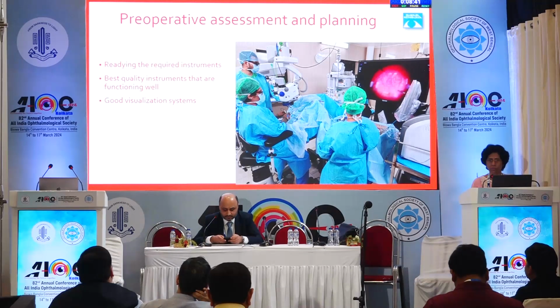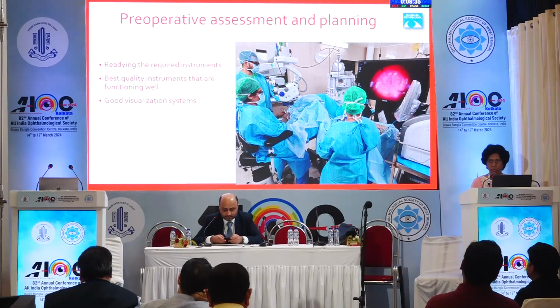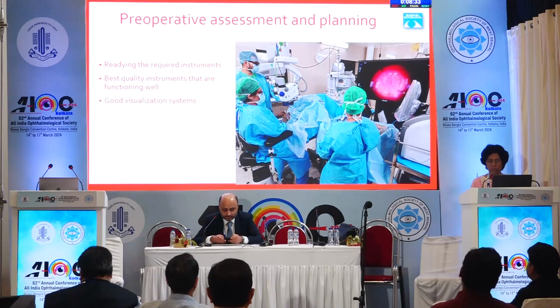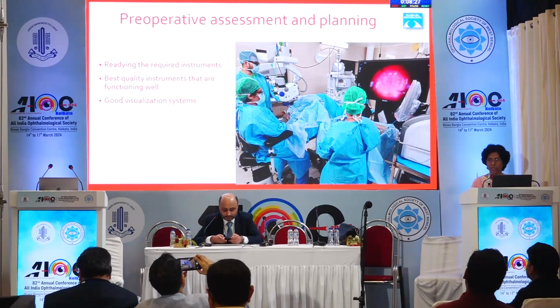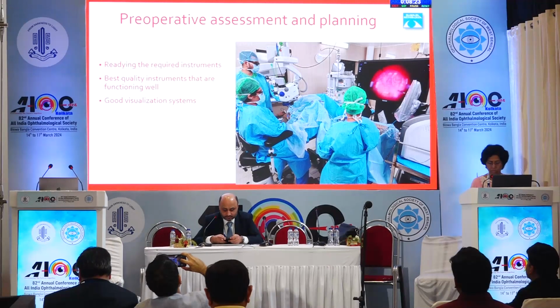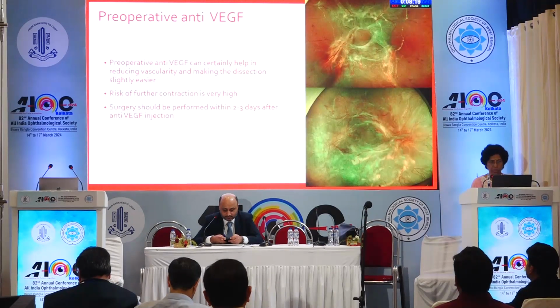Make sure that you have the required instruments ready, or use the best quality instruments which are working properly, which are probably new, and also you have a good visualization system, because all this matters a lot. Otherwise it becomes very frustrating to work with instruments which are not working, or if the visualization is not good, that adds to your complexity. So make sure everything is in proper order.